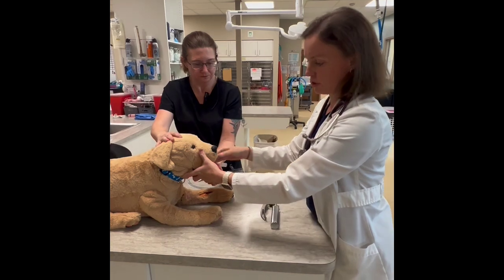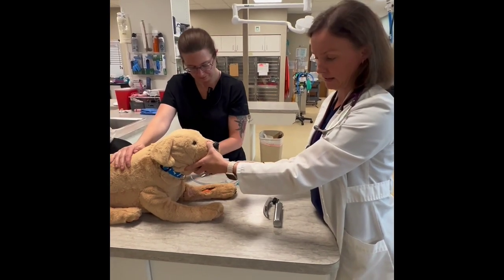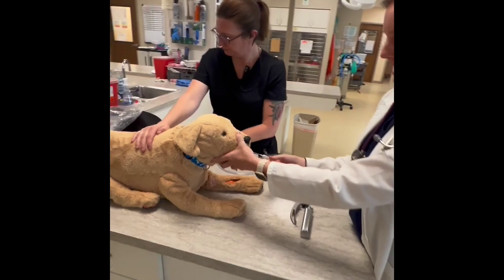Next you're going to hook them up to the anesthesia machine, which we don't have here. And then last, inflate the cuff and make sure you have a tight seal.